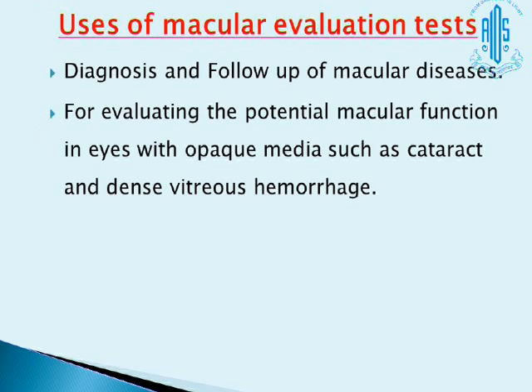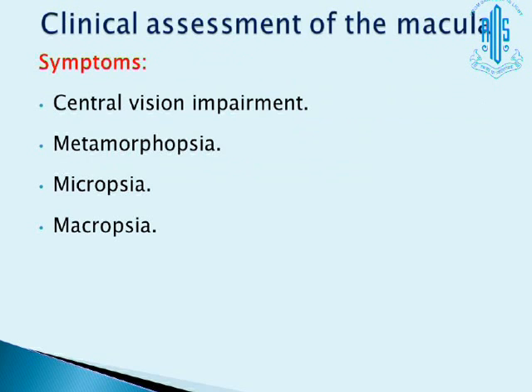Uses of macular evaluation test: diagnosis and follow-up of macular disease, and evaluating the potential macular function in eyes with opaque media such as cataract and dense vitreous hemorrhage. Clinical assessment of macula, like central vision impairment, metamorphopsia, micropsia, and macropsia.